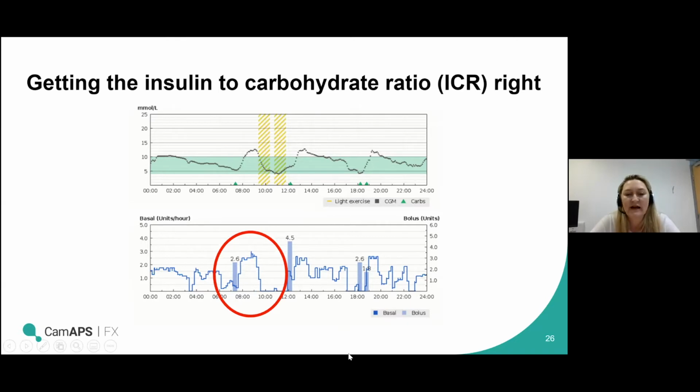And this can often happen. You can see the system can ramp up to deliver the extra, but because there's then the mismatch between the insulin absorption and the absorption of carbs, you often then find you get this dip later where, as the drop starts, the system is backing off to nothing. This person's popped ease off on, which has probably made very little difference because the system wasn't delivering anything in any case. And if you get those periods of time where the system's had to give a lot and then back off a lot, you end up with this much more up and down, roller coaster pattern.